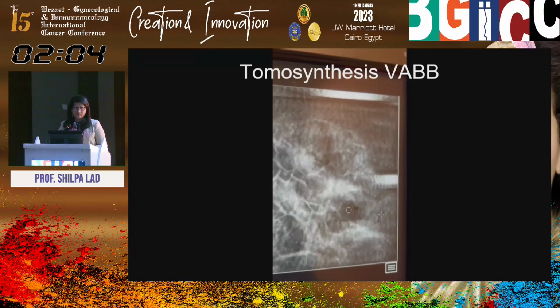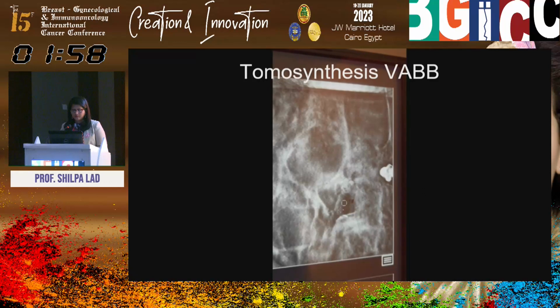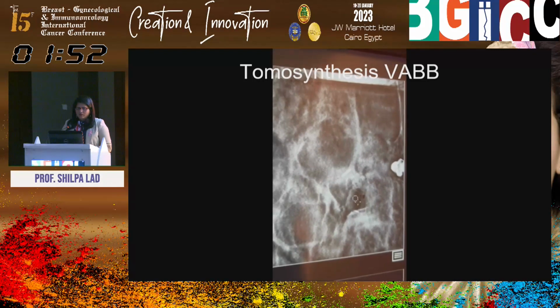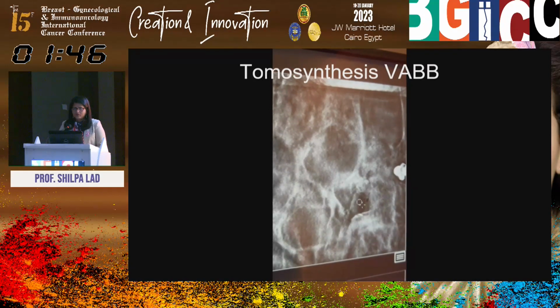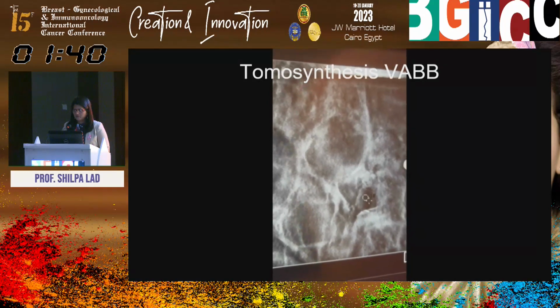Okay, we continue to see that coarse popcorn calcification right here, and a cavity at the spot of the microcalcifications that were there. So this is a successful procedure, but that also means that we need to leave a marker clip at the site of the biopsy, such that if this comes positive for malignancy or pre-malignant lesion, then the surgeon should know exactly which spot we have biopsied.